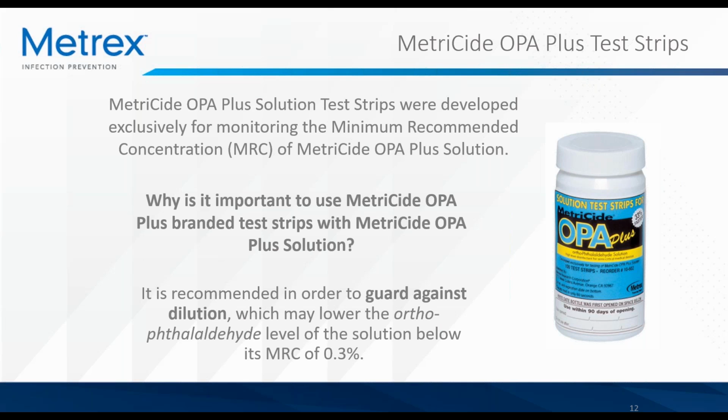Because MetriCide OPA+ solution can be reused for multiple rounds of high-level disinfection of various devices, it's important to monitor the viability of the solution between each use to ensure there is enough active ingredient to achieve high-level disinfection each time. MetriCide OPA+ solution test strips were developed exclusively for monitoring the minimum recommended concentration, or MRC, of MetriCide OPA+ solution.